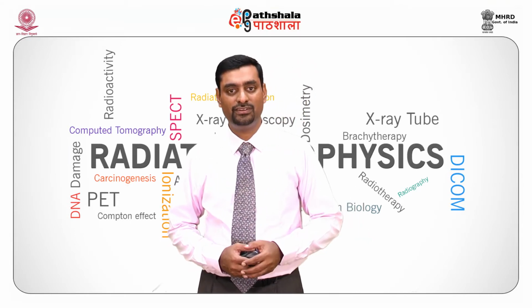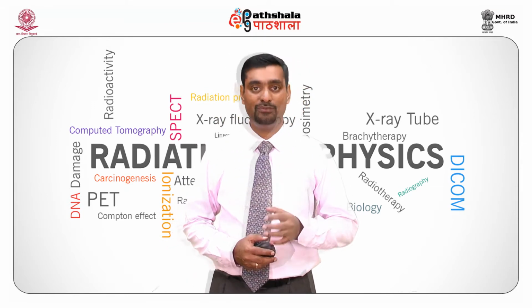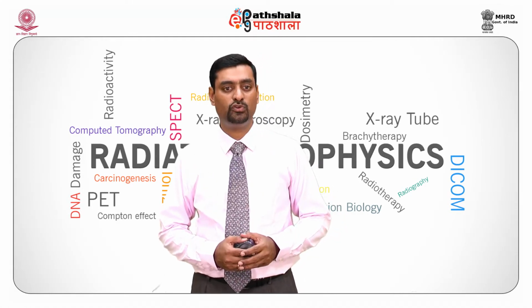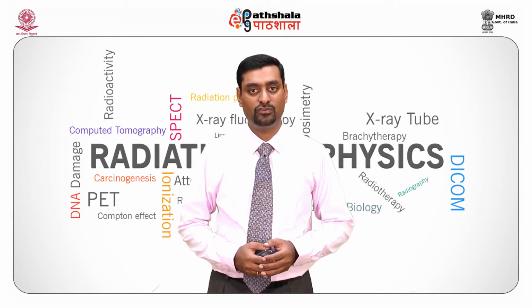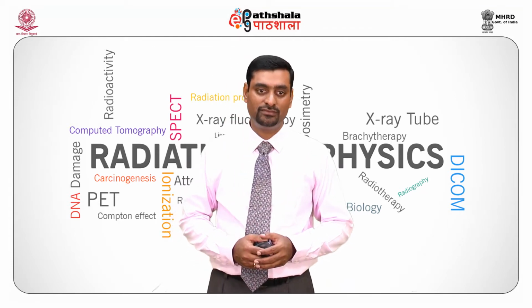Film screen radiography is a branch of radiographic or photographic technique which uses films as a recording medium to record an image produced by an electromagnetic radiation. It can be either from X-rays or from any electromagnetic source. Generally, in radiology, we use X-rays for imaging.